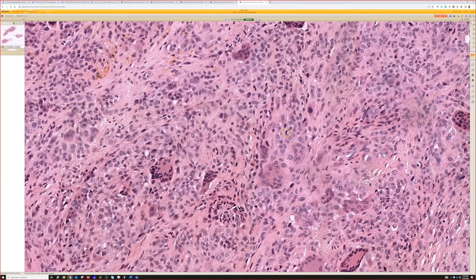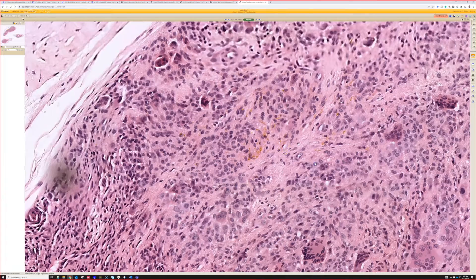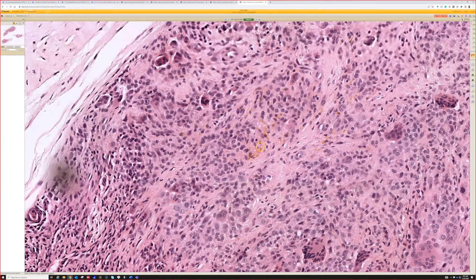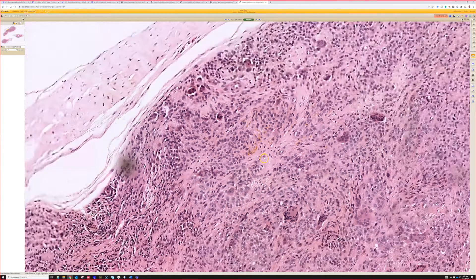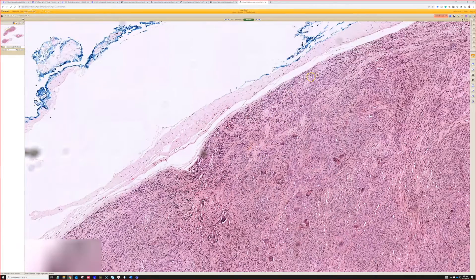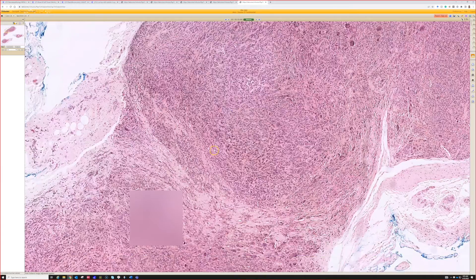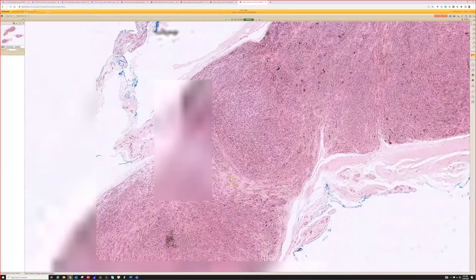There's a mitosis — do not be afraid, that's okay. There's the hemosiderin, and there are also often foam cells present, usually around the periphery. This case didn't have much of that.